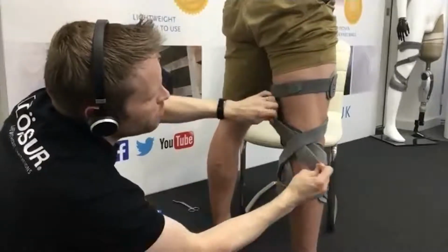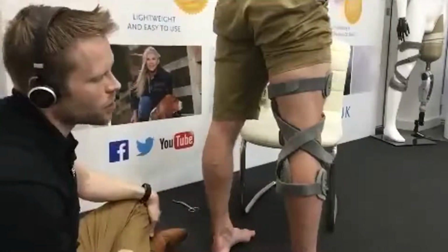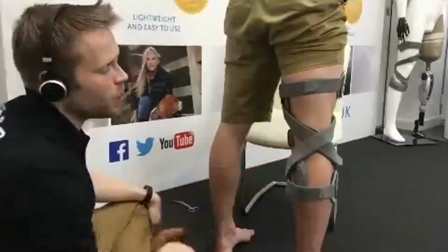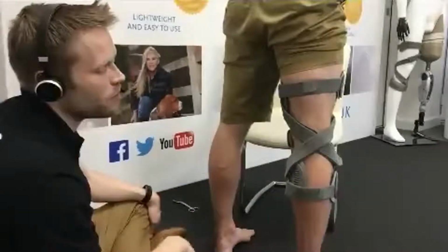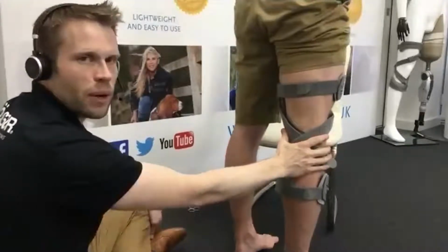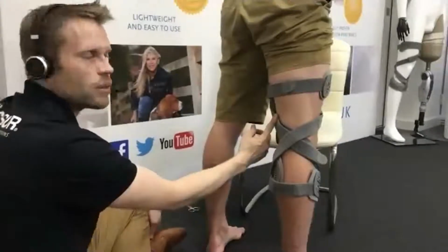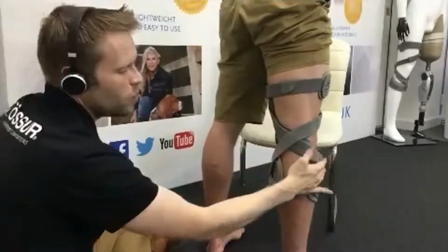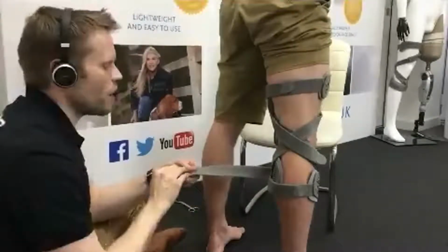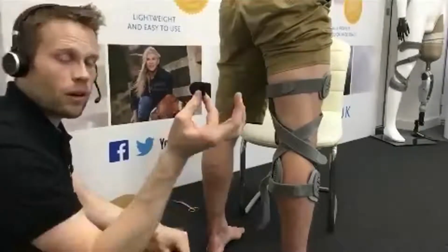Now, what's really important is that we don't sort of set up the brace in this position. So can you see that we've got double thicknesses of strap in the popliteal region? So if Pete was to flex, you can see there's a lot of bunching, there's a lot of material behind the knee. So what we want to do is bring these straps back out towards this region and remove this excess of strap.